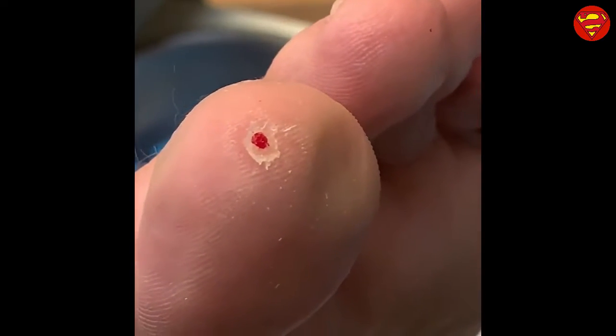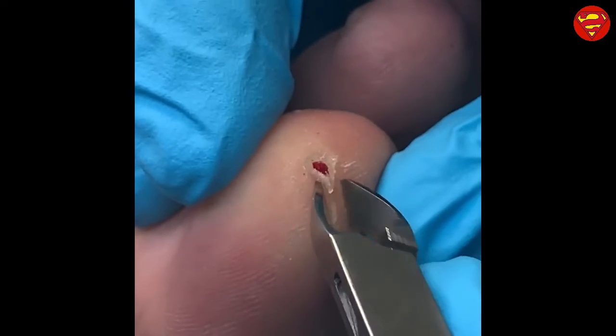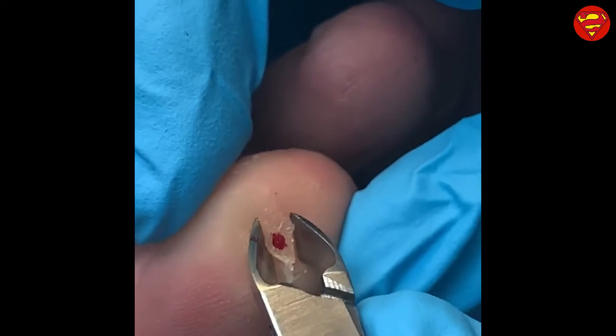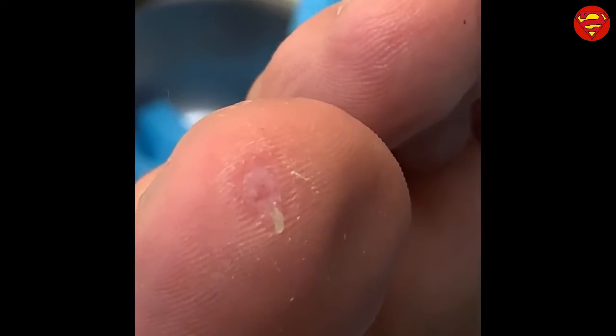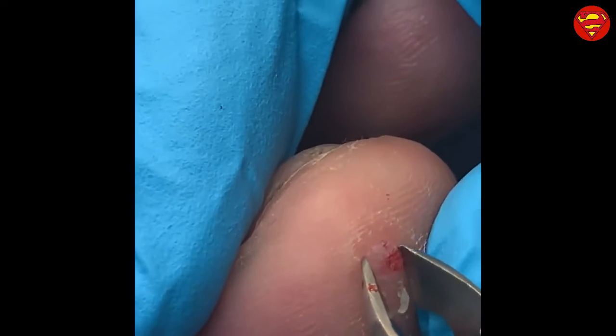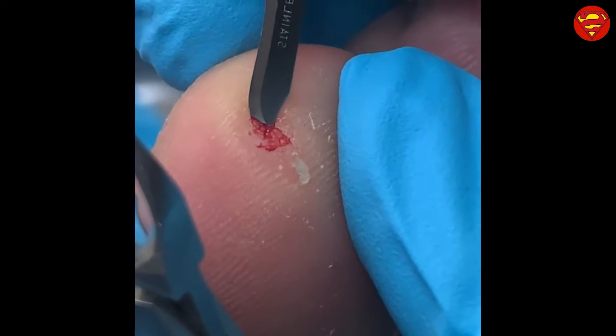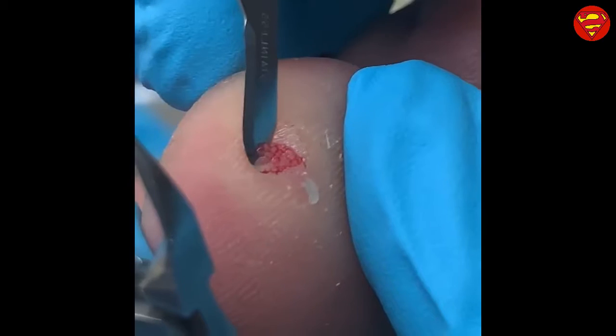So that part's good. I kind of just use the blade around it, and then I use this guy as the scooper, for lack of a better phrase. And we don't want to go further than the basement membrane of the skin, because if we do go past the basement membrane, then you can cause scarring, which would obviously be not ideal for the patient. And a little bit more. Good.